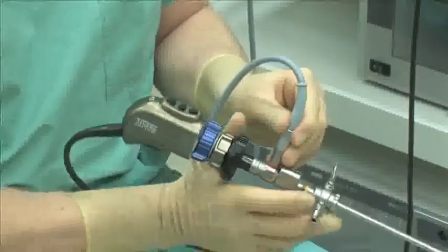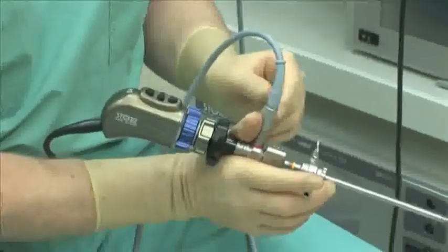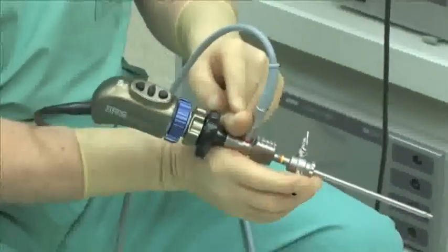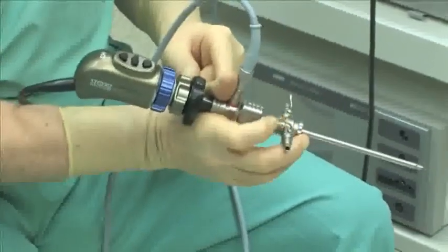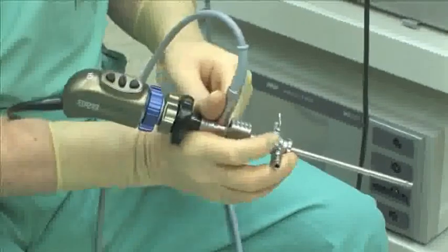But if we grasp the system with 2 fingers placed on the stopcock valve and the thumb on the light cable, we achieve better guidance. In addition, we are able to control suction with the index finger if needed.